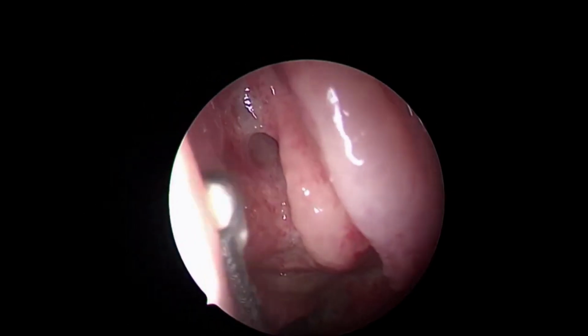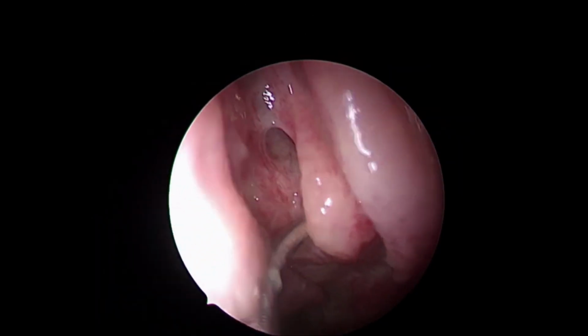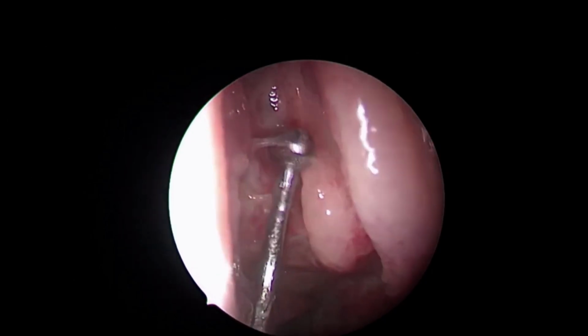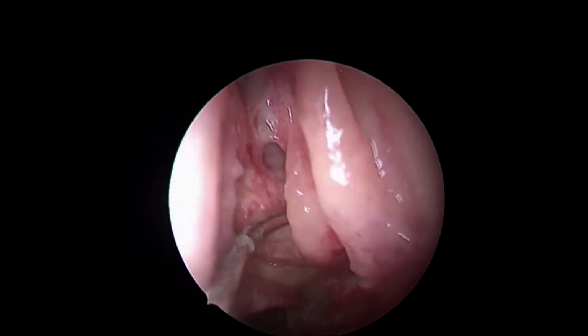Then this turbinate, as you go behind, turns laterally in the coronal plane to insert onto the lamina papyracea. That is the second part of the turbinate lying in the coronal plane. And this space anterior to this and behind the bulla is the retrobular recess.